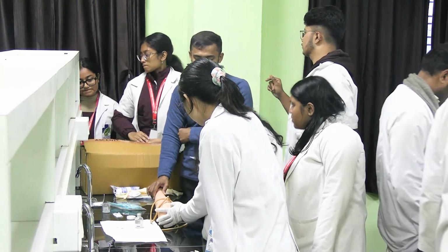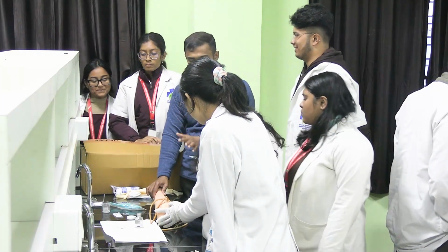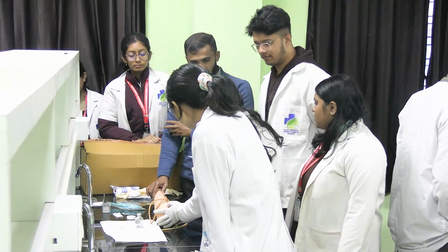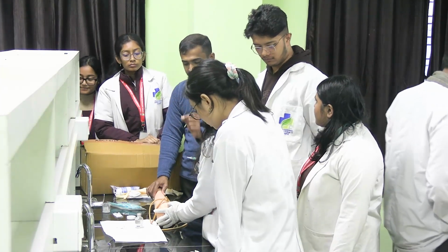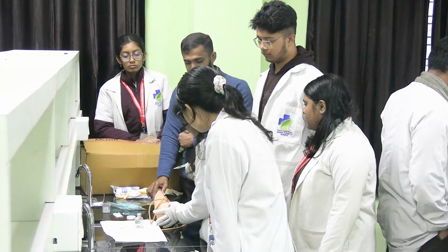You have located the site. Then you have to disinfect it. Disinfection done. Now it is the procedure for introducing the needle. How will you introduce? What is the technique here? It is the Z-track technique.